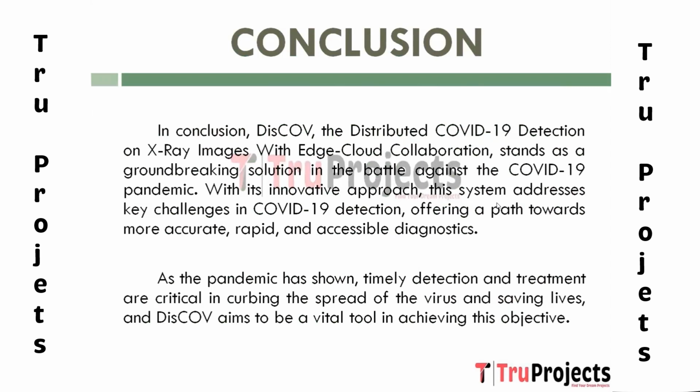The author mentioned to use deep learning models like DisCOV benchmark model-based Inception v3, LDT algorithm-based MobileNet v2, and SqueezeNet-based LXNet, in which LDT got 94% of accuracy. We applied the same model with COVID-19 data, and from that, the MobileNet v2 based LDT algorithm got 99.5% accuracy. So with MobileNet v2 we built the model and it is used for detecting the result for the user input. So here we have completed with our project.